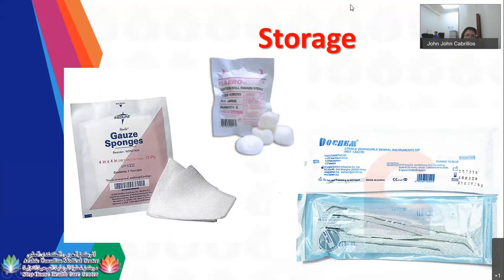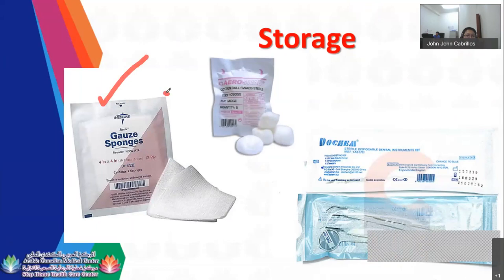Aside from the instruments you are processing, there are some purchased instruments which are sterile, or purchased consumables which are sterile. For this one, this is your sterile sponge or gauze, sterile gauze. So you can store this together with sterile instruments, okay?